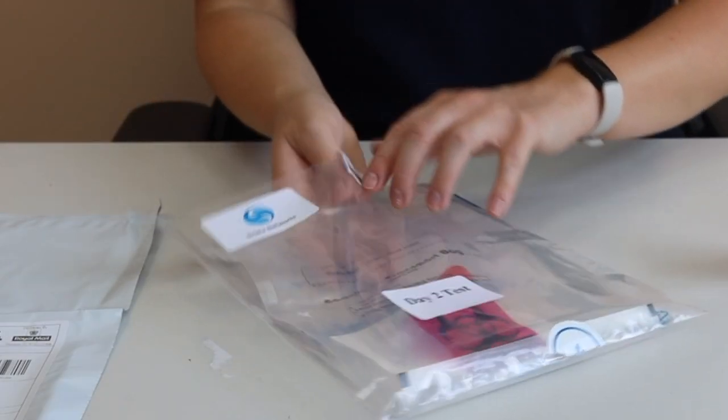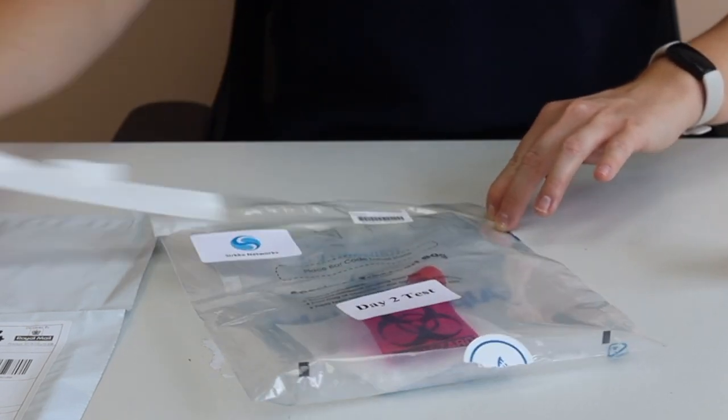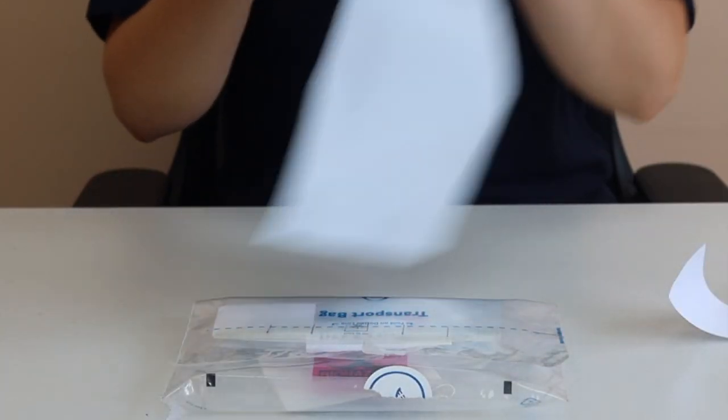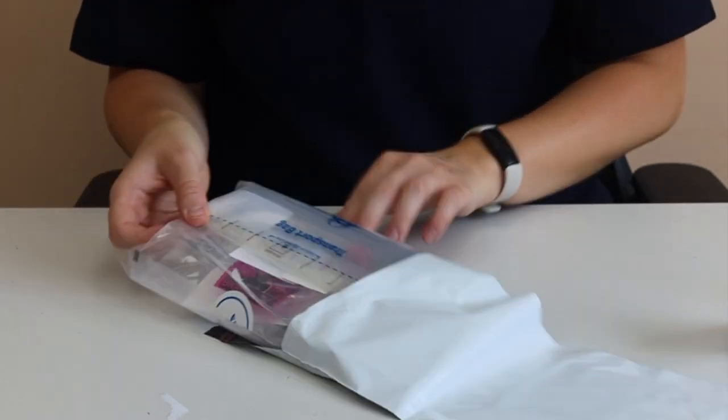Place the sealed biohazard bag into the clear specimen transport bag and seal it. Then place the clear transport bag into the track 24 envelope and seal it.